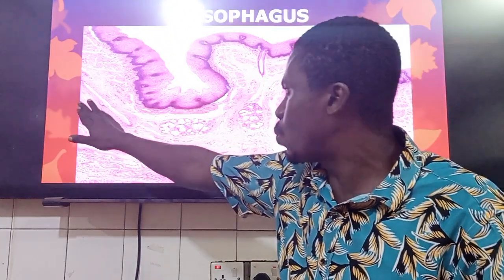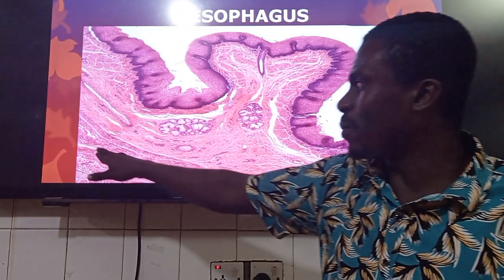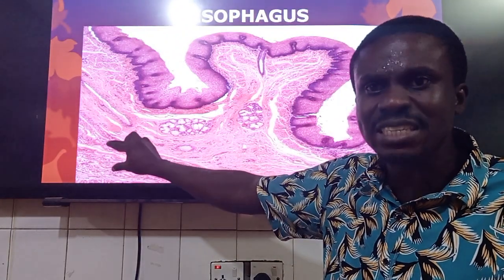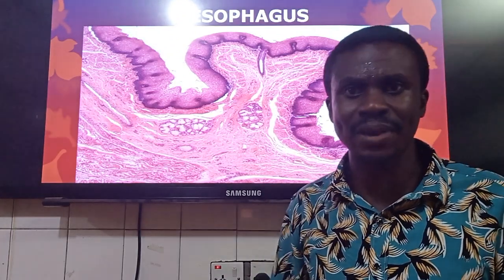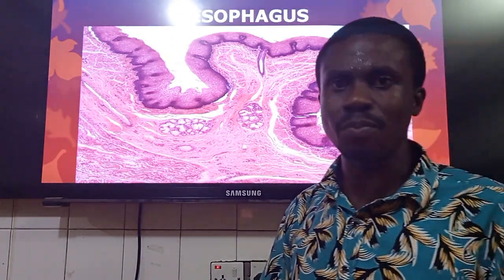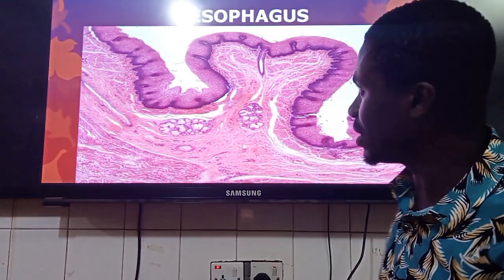And then from there, you go to what we call the muscularis externa. Whenever we talk about muscularis externa, we are going to have the inner circular and of course outer longitudinal layers. This one doesn't show the full extent. We have an inner circular and outer longitudinal muscularis. I've done these videos, remember, I've said these things so that you can go and get these videos and watch.